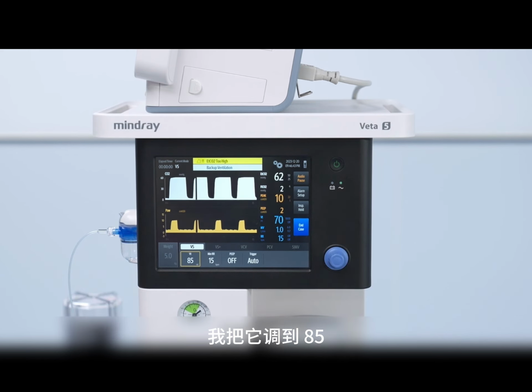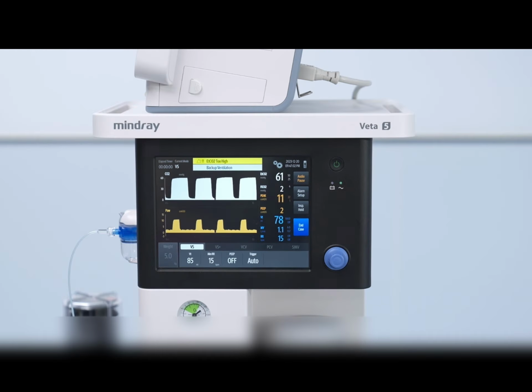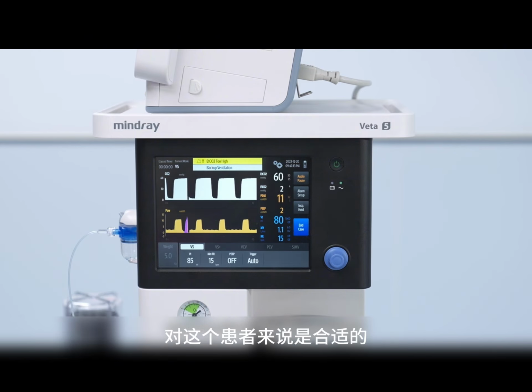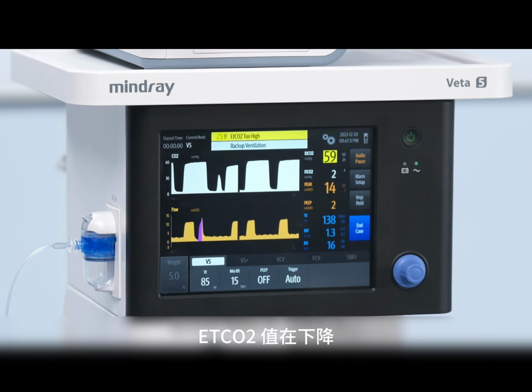I put it to 85. Okay, it's slowly coming down. Now the peak inspiratory pressure and the resulting tidal volume are more reasonable. So I believe this tidal volume is more or less appropriate for this patient. And the CO2 value is decreasing.